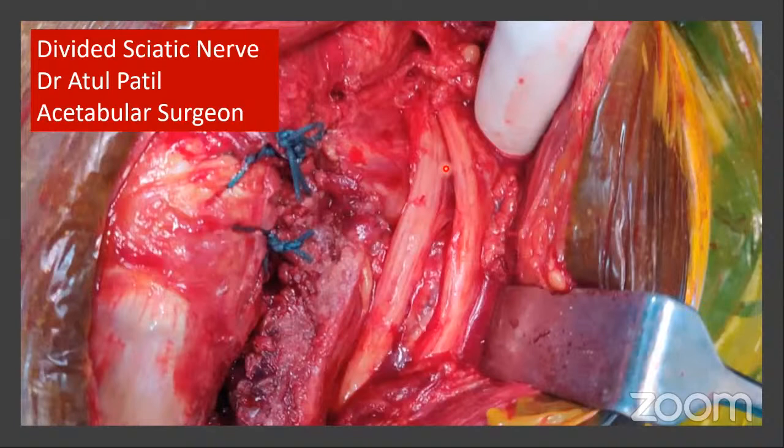I was going to ask you, with the ultrasound, with the hydro dissection, can you make out whether you are intraneural or perineural? Because now with the newer needles, echogenic needles, you can even see the tip properly. So is it possible? Because I am not as experienced as you with ultrasound-guided blocks. Yes, you're absolutely correct, Shailesh. That is what I wanted to ask Ganesh. He mentioned you have to confirm intraneural injection. So is there any study which mentions the volume of test dose for intraneural injection, Ganesh?